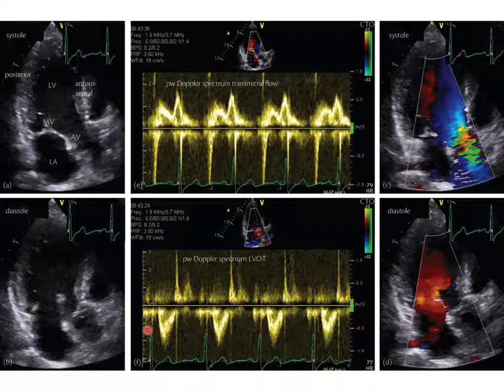One thing that you really want to detect is whether or not a valve actually is stopping the blood when it should be. You can sometimes hear that, but it's very difficult to understand just how badly the valve is damaged or not working just from sound. You'd really like to see what's the velocity of blood going the wrong way through that valve. And so this is a mitral valve. This is the left ventricle. Top of the left ventricle is the aortic outflow tract. The blood should all go out here. The mitral valve should shut when the ventricle contracts.